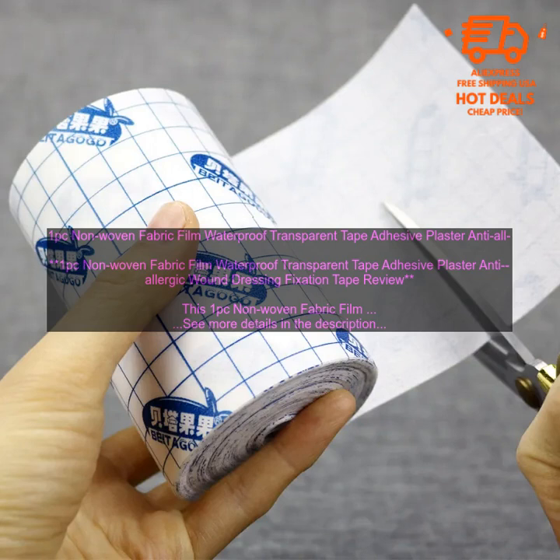Here are some of the benefits of using this tape. Waterproof: the tape is waterproof, so you can be sure that your wound will stay dry and clean, even if you get it wet. Transparent: the tape is transparent, so it is discreet and will not draw attention to your wound. Non-allergenic: the tape is hypoallergenic, so it is ideal for use on sensitive skin. Breathable: the tape is made of a soft, breathable fabric that is gentle on the skin. Easy to apply and remove: the tape is easy to apply and remove, and it leaves no residue behind.